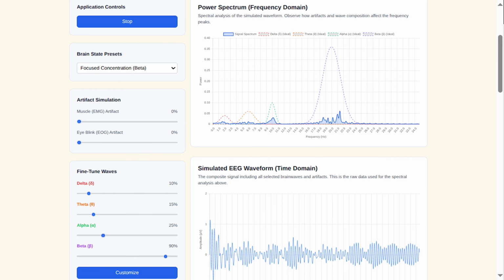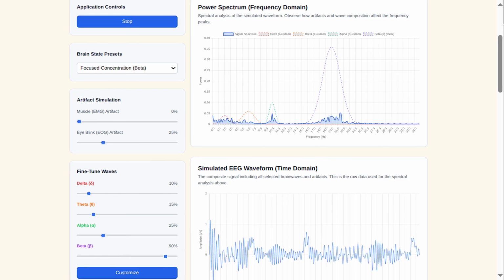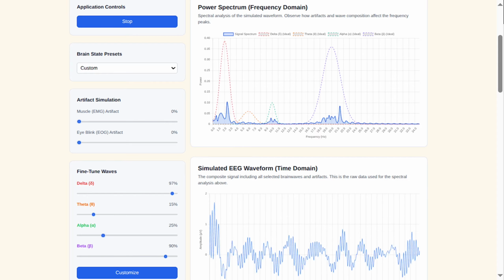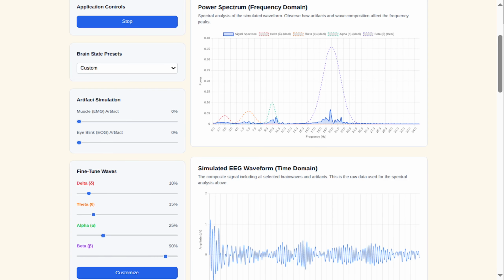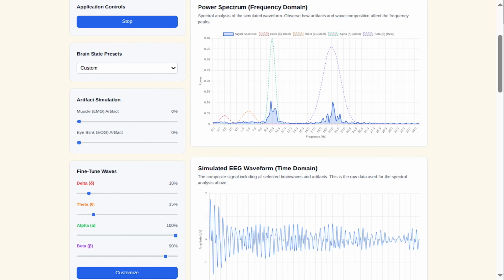Hey, can we go into those? Intracranial electrodes are implanted directly on or in the brain, offering extremely high-resolution signals from deeper structures. They're often used in epilepsy surgery planning or deep brain research, but they require surgery and are more invasive than scalp EEG. Okay, and what's between intracranial and the surface?